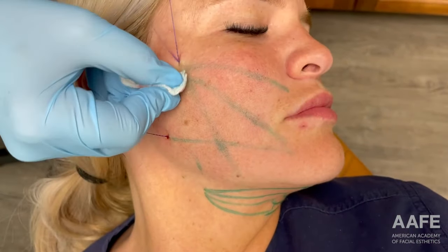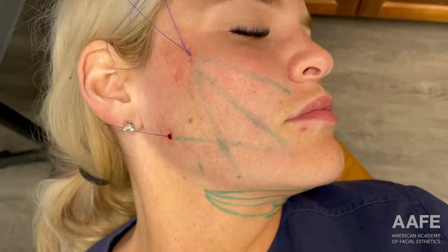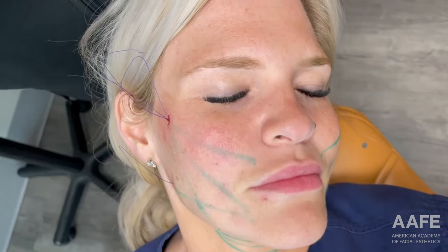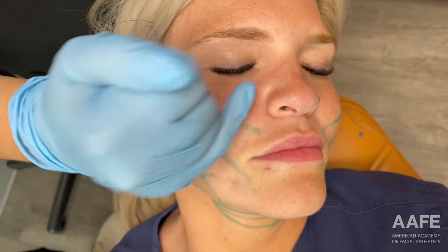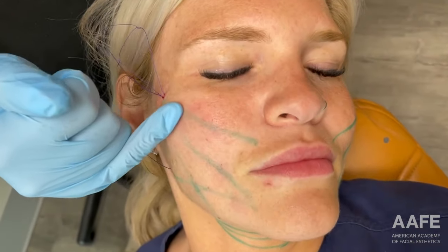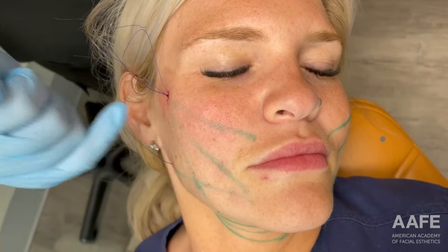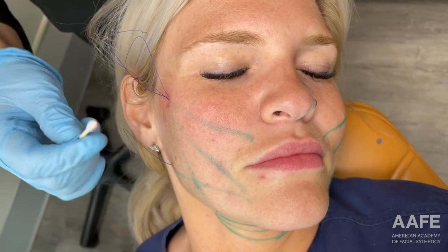So we've done our four vectors: nasolabial fold, marionette, jowl, and jawline. Now I'm going to sit her up and see how we did. We sat the patient up, evaluated, and she does have a beautiful improvement. However, one of her main areas of concern was her nasolabial fold, and we just want to give her a little extra pull. So we're going to place an additional thread down to the nasolabial fold for a little extra reinforcement, given that that was one of her most bothersome areas. We already have the access point, so we can just drop another thread in through there.